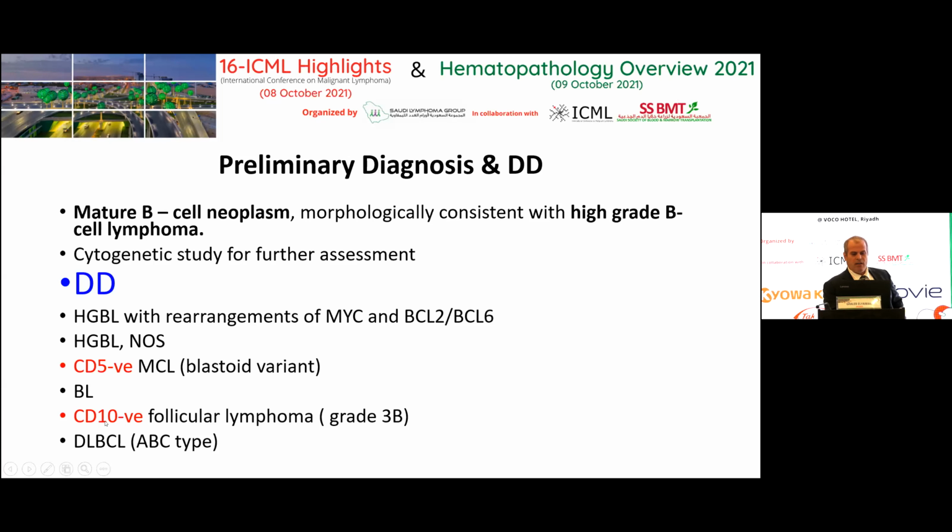Maybe also CD10 negative follicular lymphoma grade 3B, which can also be confused with high-grade B cell lymphoma. The other issue may be diffuse large B cell lymphoma.